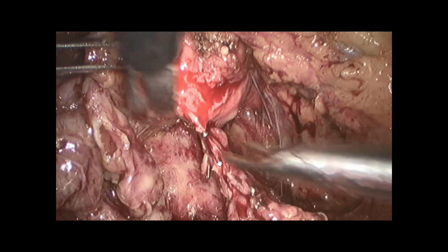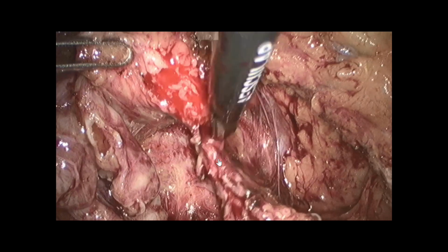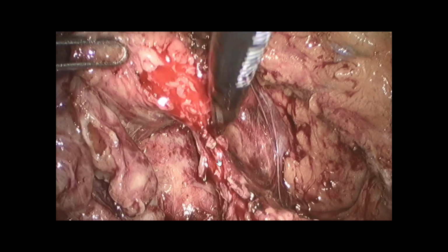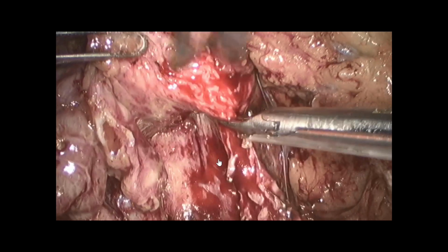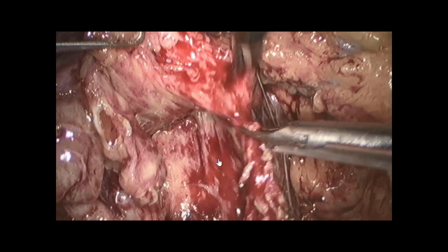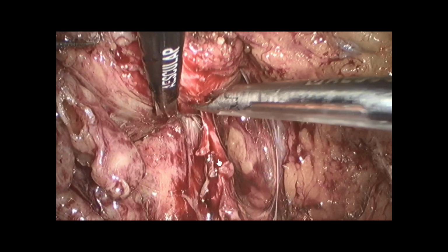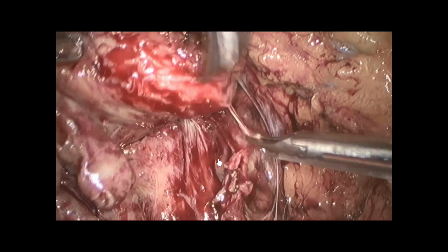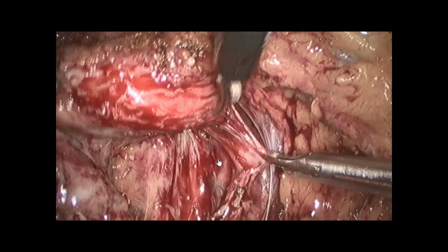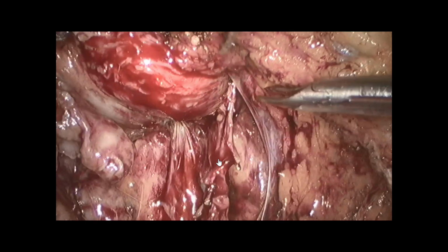Always very important to redo the central dissection, and then clip. Always redo the incision. Very important here to develop the space of the rectum, and then slowly you turn the prostate, and then you will finish.